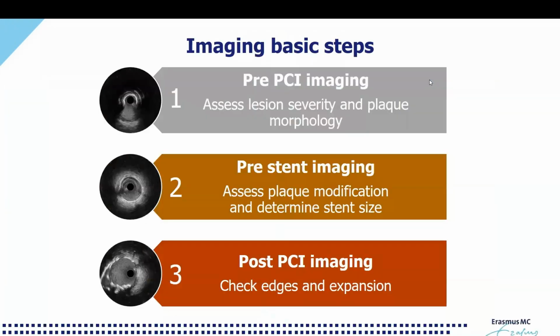Yeah, this one, and that's why we see these imaging basic steps that before you start your PCI, you want to know what you're dealing with, if there is calcium or not, or if you have to treat it, and that's why you do a pre-PCI imaging. And with that one, you just check on your calcium.